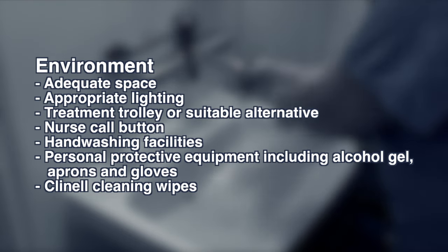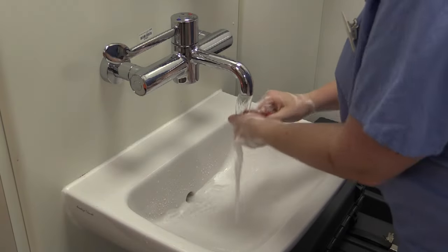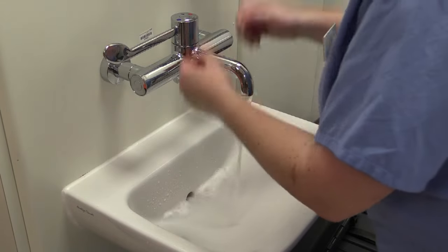Prepare the equipment using aseptic non-touch technique practice and wash hands as per hand washing policy. Introduce yourself to the patient and gain verbal consent. Preparing the patient is crucial.